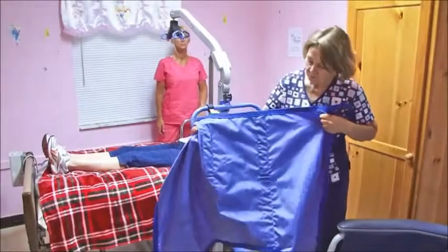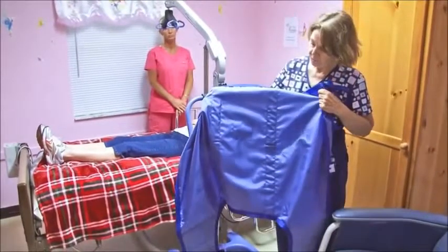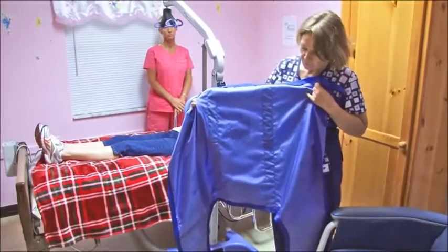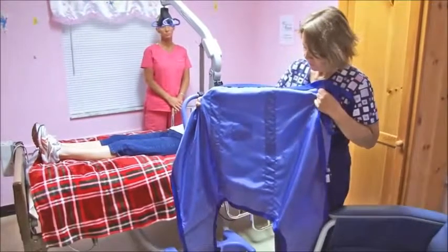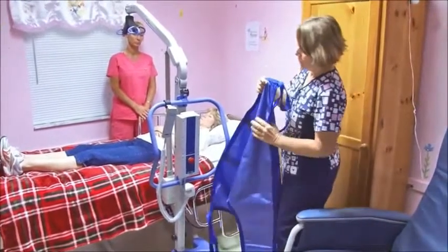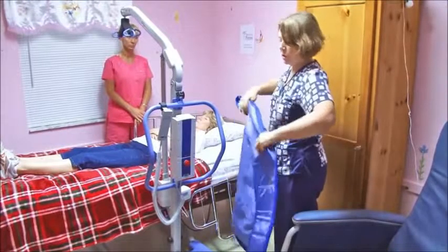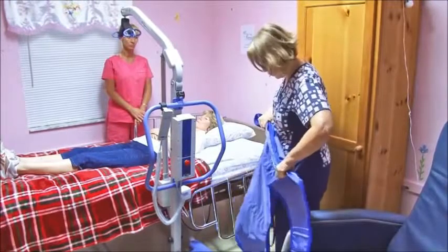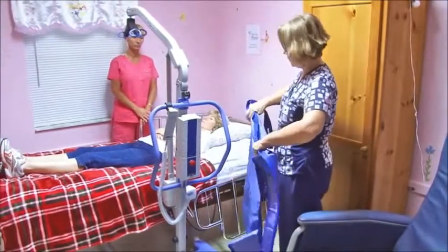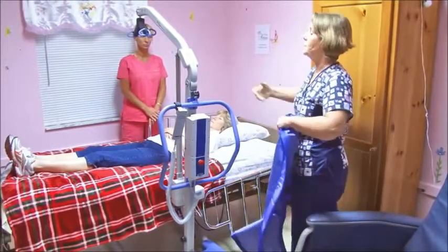This is the sling. This is the inside that will be to the resident, because it doesn't have any loops. So the smooth side to the resident. Then you're going, this is the top to the shoulder. We will be rolling the resident towards the window, towards Beth, and I'll be placing this underneath the resident, and then we'll roll the other way.